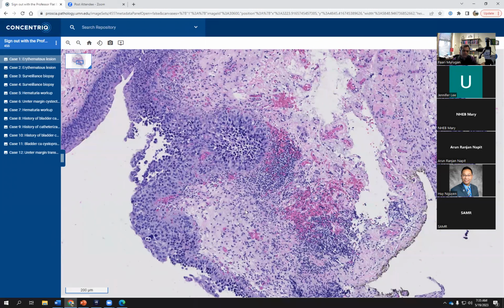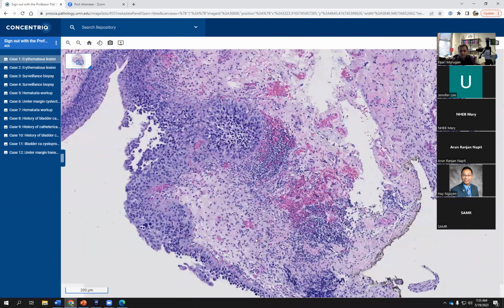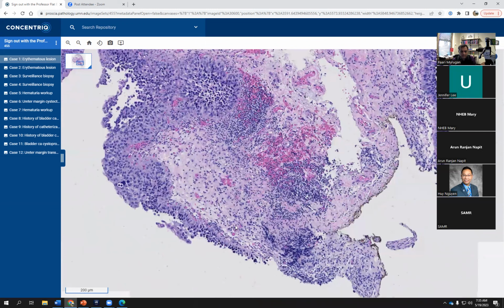But in all other situations, let's say the urologist says the lesion is recurrent, okay, then you don't need to really worry about whether you're calling it flat or papillary, because anyway, it's going to be classified as a high-grade lesion. Or let's say when the urologist biopsies two areas in the bladder for the first time, and both these areas show high-grade tumor, and it's equivocal like this, then also you need not worry, because anyway, multifocal lesions will be categorized as high-risk category.